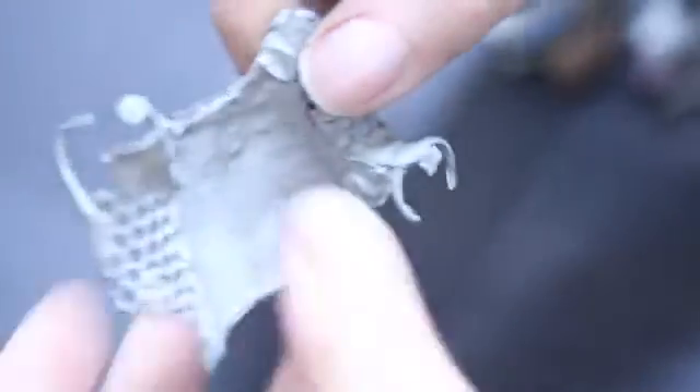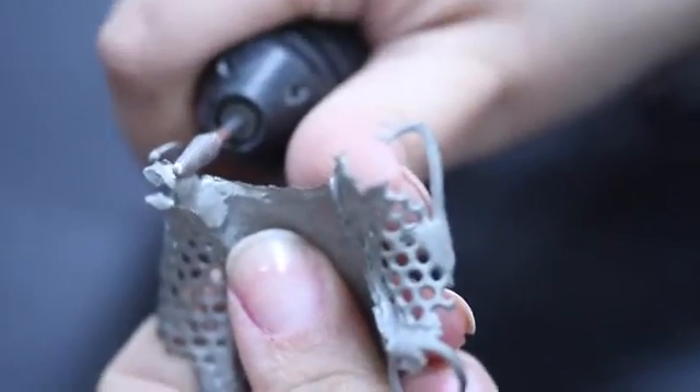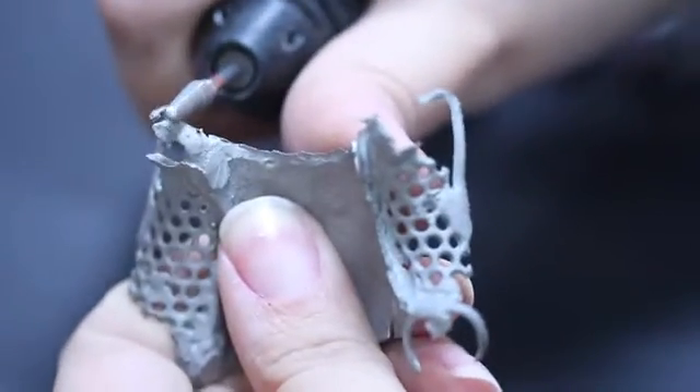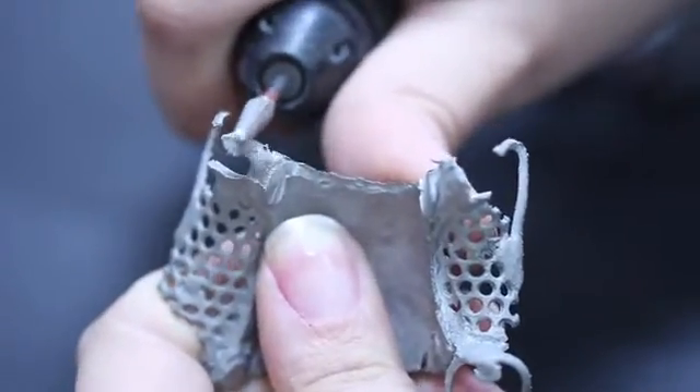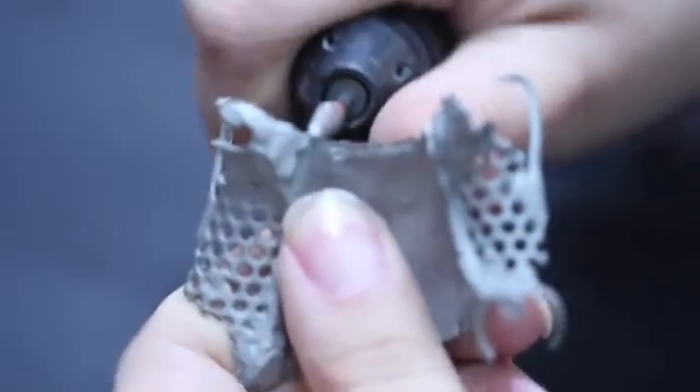retentive clasp tips, and proximal plates must receive an absolute minimum of finishing. The clinician should carefully inspect these areas when the framework is returned from the laboratory, and has every right to be concerned if evidence of over-finishing exists.